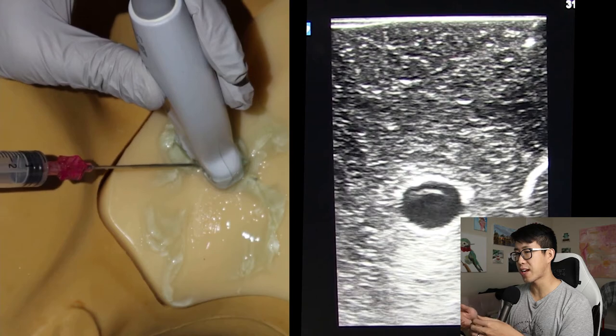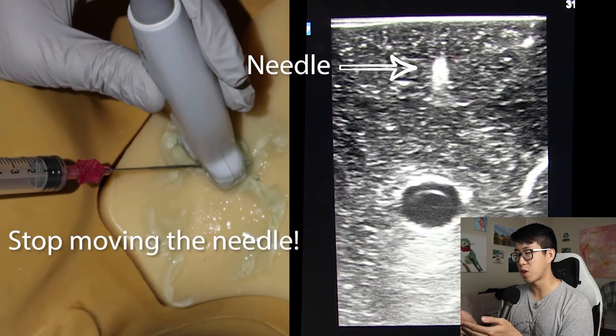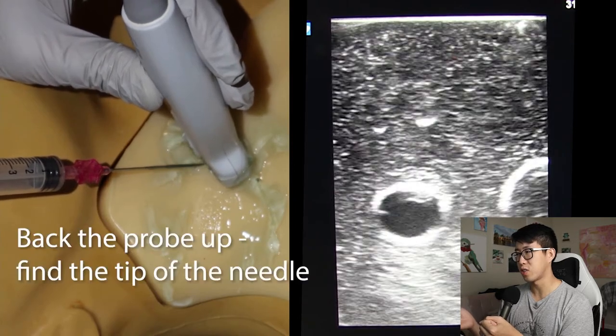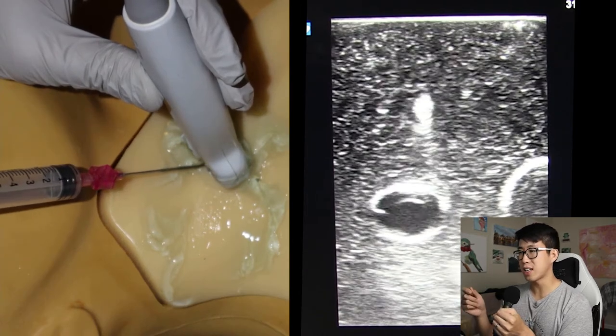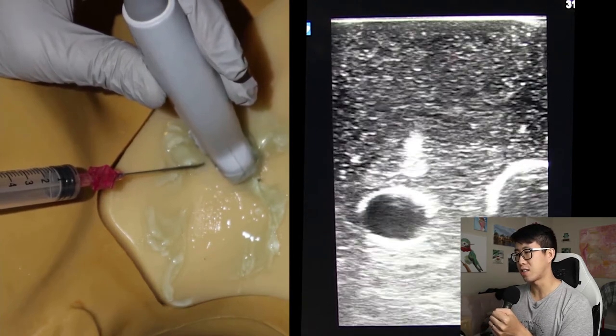With the creep method, you advance the needle until you see the needle tip, then move your ultrasound probe until the needle tip disappears, and then advance your needle slightly more until the tip reappears into view. A lot of times when people are looking for their needle tip they just look at the screen and say they don't see it, but the key is that you need to move your ultrasound probe in order to follow the needle tip down to the vessel.